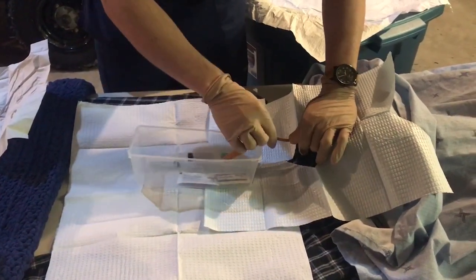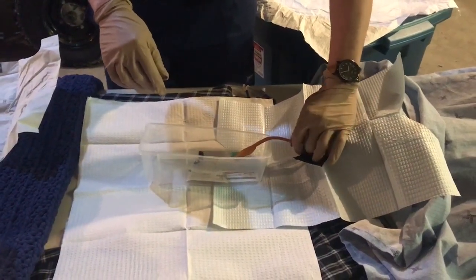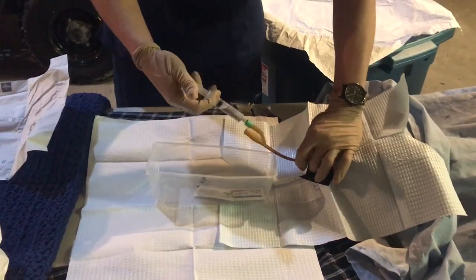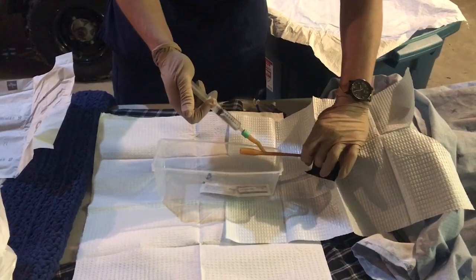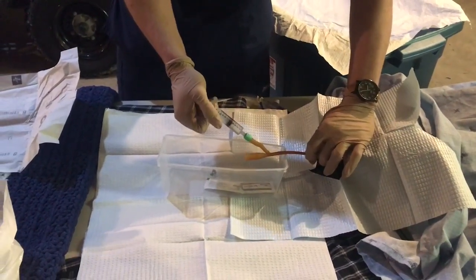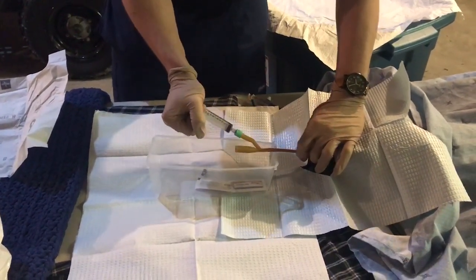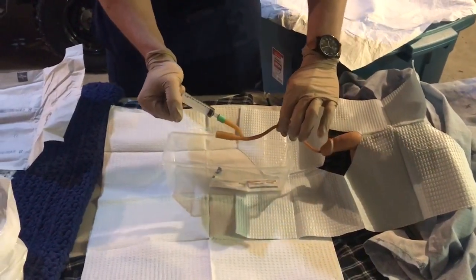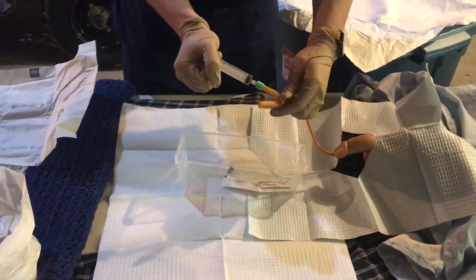So there we go. Now I'm going to move my index and thumb to stabilize the catheter tubing at the tip of the meatus there. For when I inflate the balloon, I'm going to inflate the balloon with the sterile water. Once that is inflated, I'm going to maintain palm pressure on the syringe. Gently pull on the catheter until I feel light resistance. So there's light resistance felt. That means that it is held in place.